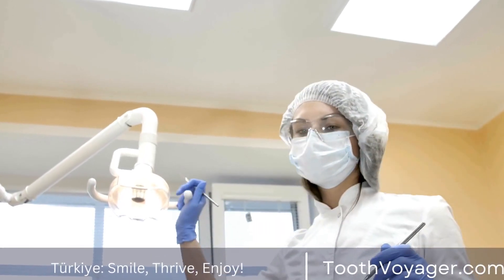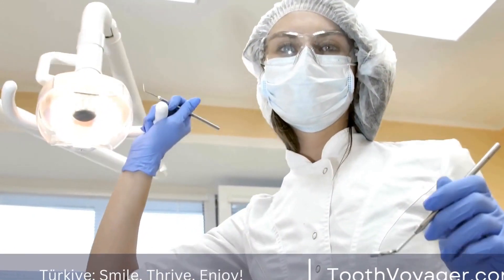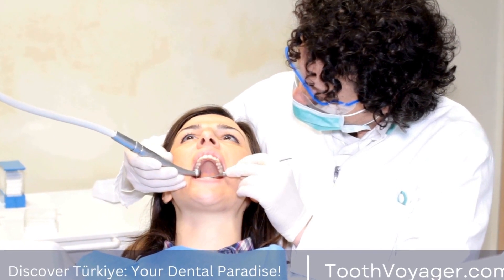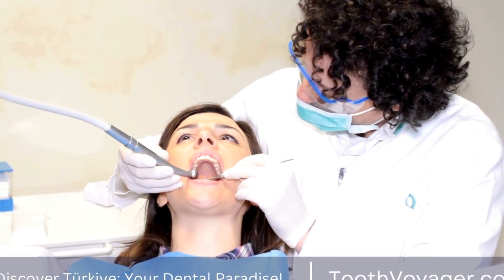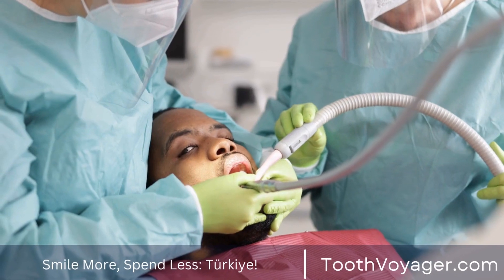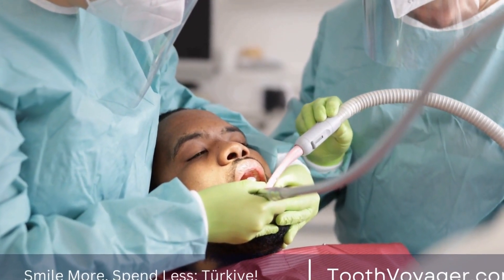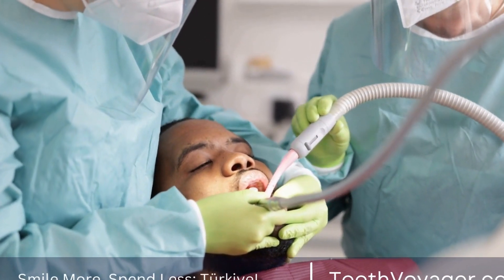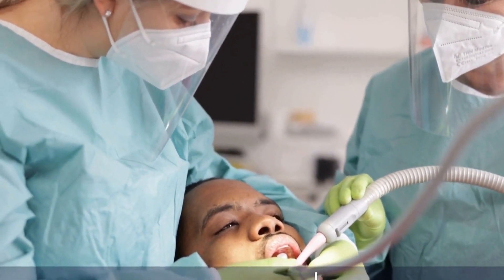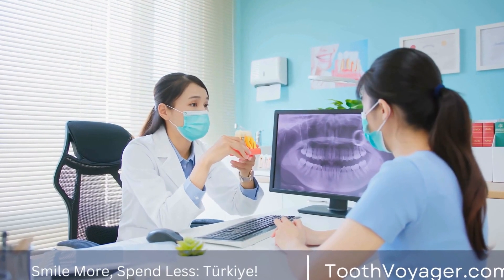From Concept to Smile: The Creation of Dental Veneers. When it comes to achieving a perfect smile, dental veneers have become increasingly popular in recent years. These thin shells of porcelain or composite resin are custom made to cover the front surface of a tooth, improving its appearance and function. But have you ever wondered how dental veneers are created?